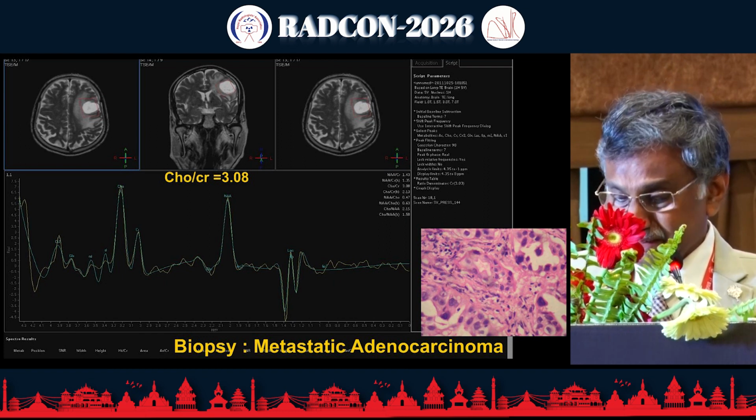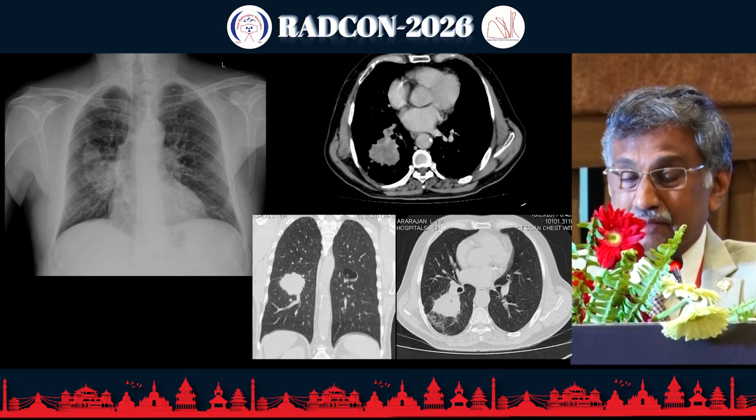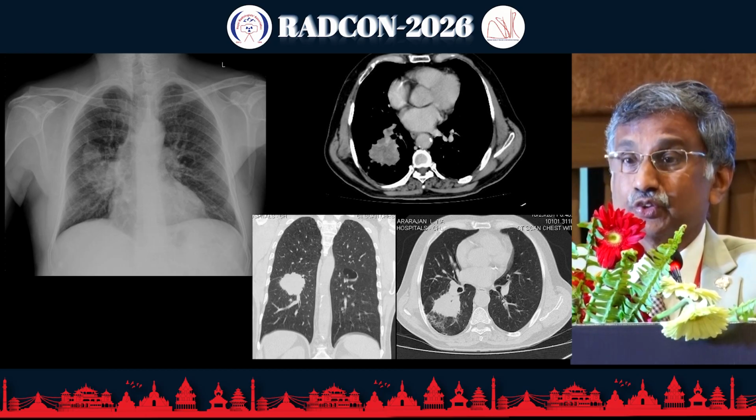As the first talk by Sayani said, you should be a clinical radiologist. This patient went back, and the X-ray test shows there is a lesion.